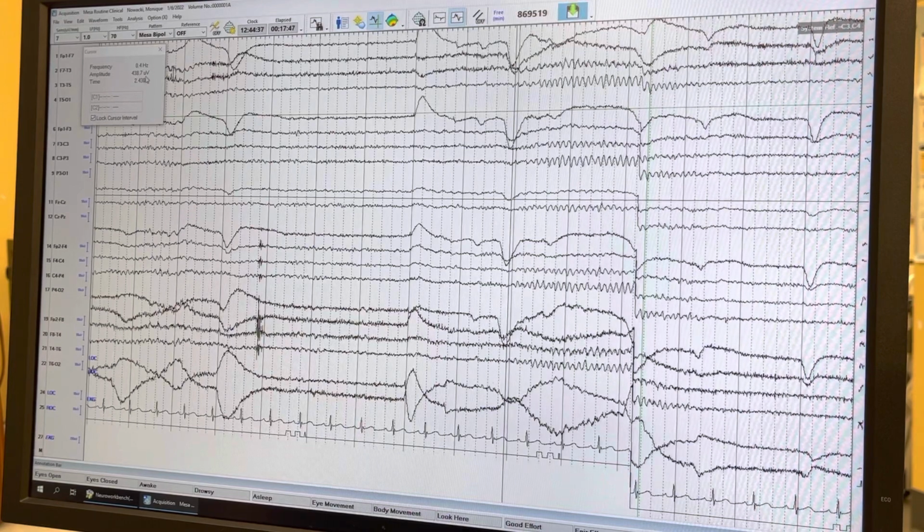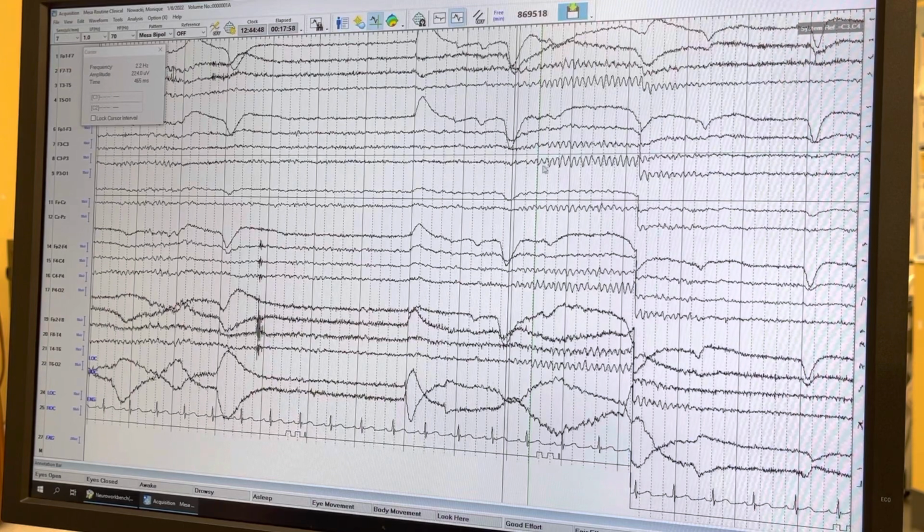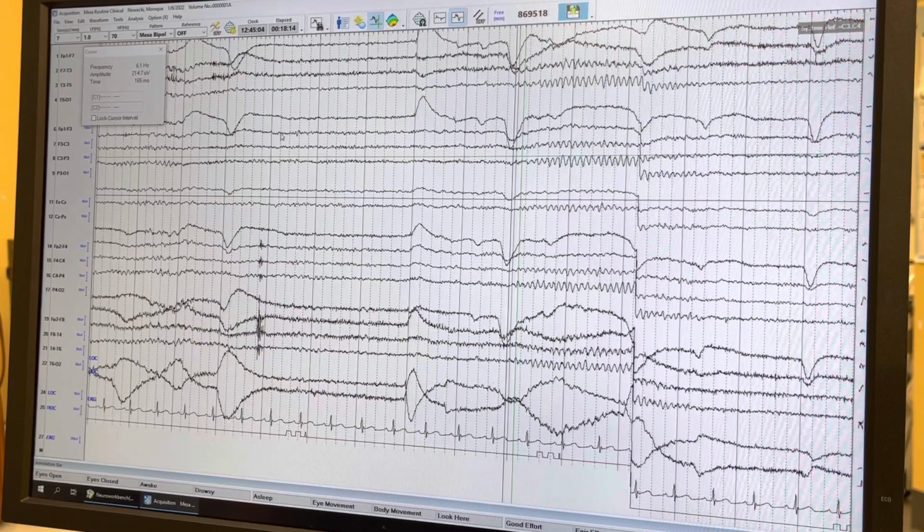Although, again, I don't know. We'll have to go over this a little bit later. I'm not entirely sure how to use this thing yet. Okay, but anyway, it's still recording in the background. So this is like a time and voltage measure. It seems like it should be a little easier to use than this.